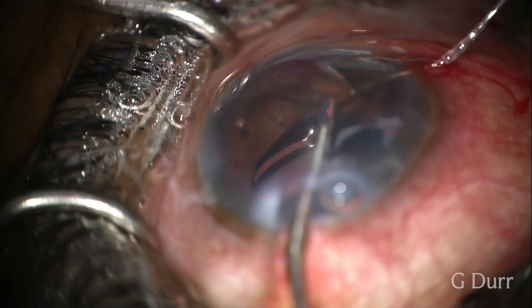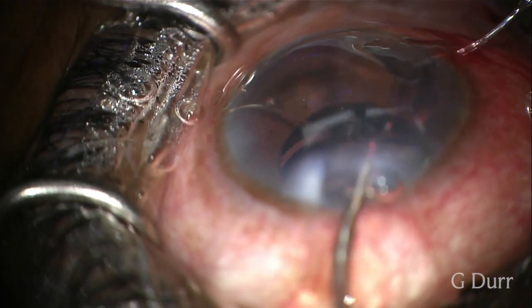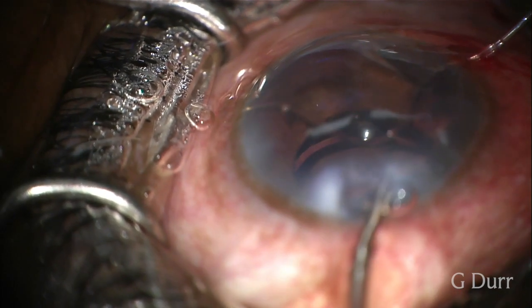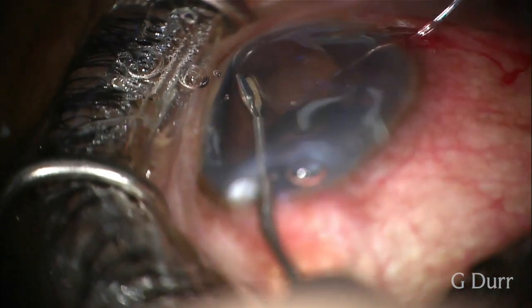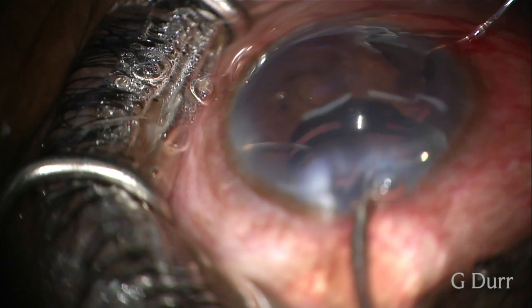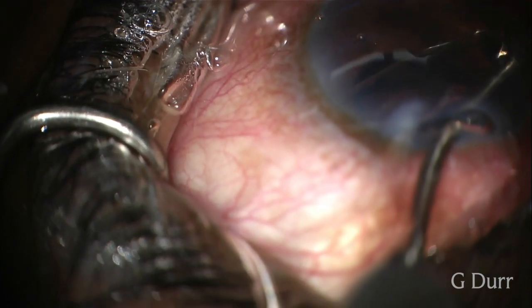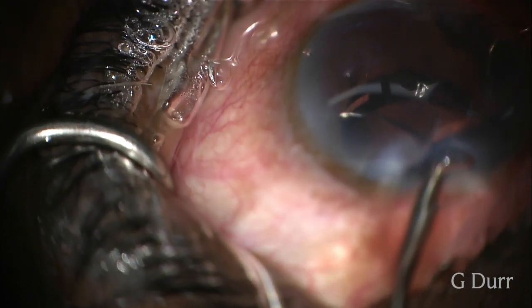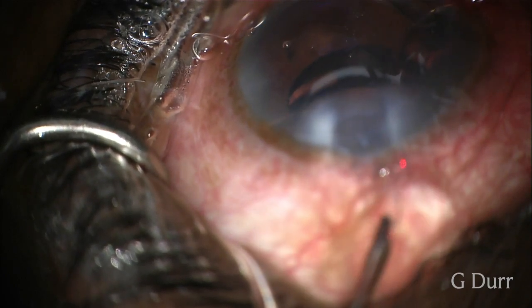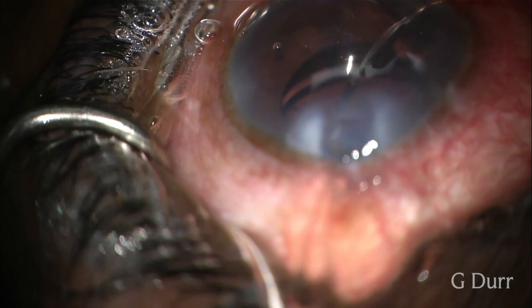And at this stage, we're going to grasp our eye track and pull it out through the main incision. And we're going to re-grasp in order to get as much of the eye track out. And this is a bit of a tricky move here, to be able to pull it out without getting it to escape from the canal without doing the goniotomy.